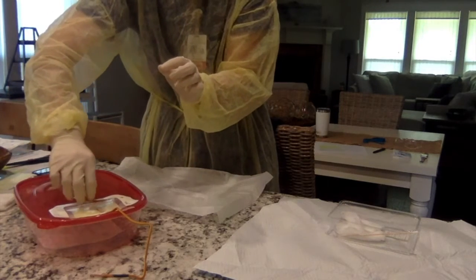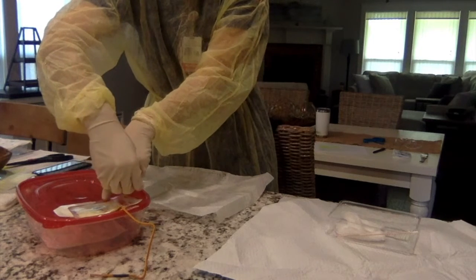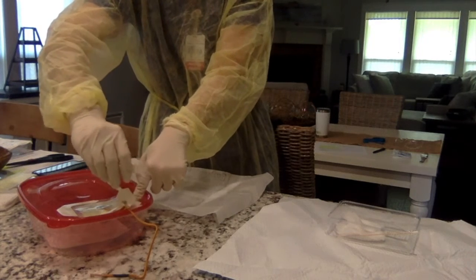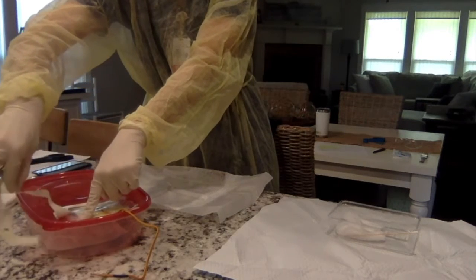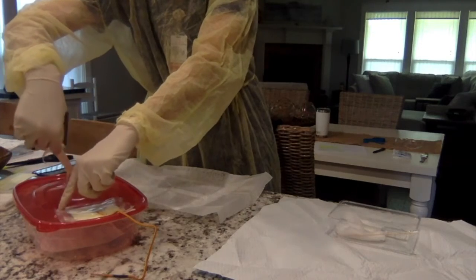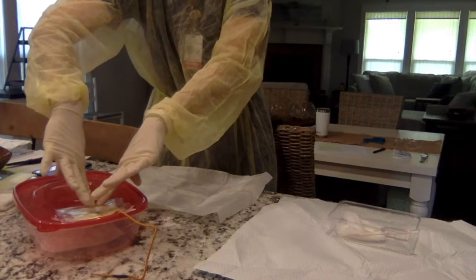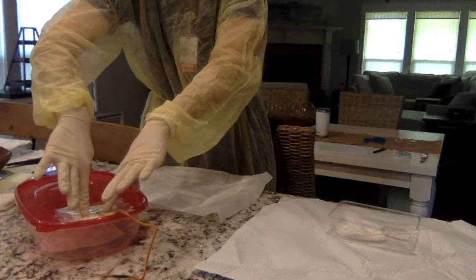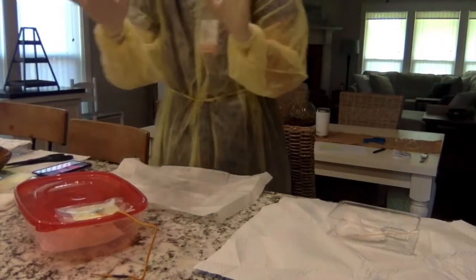Now I'm going to undo it. And now that I've placed it on there, I'm going to make sure that it is on there tight with no creasing. And it is on there tight.